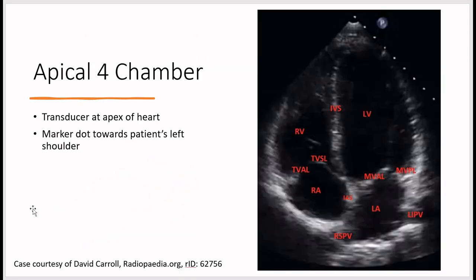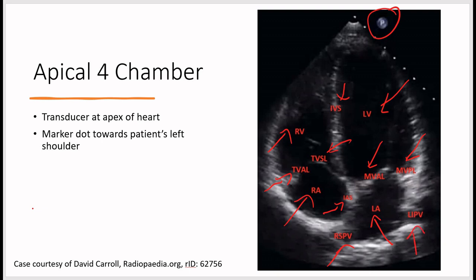For the apical four chamber view, move the transducer to the apex of the heart and point it upward toward the patient's head to reach the base of the heart, with the probe marker toward the patient's left shoulder. Structures include the left ventricle, interventricular septum, right ventricle, tricuspid valve with anterior and septal leaflets, right atrium, left atrium, atrial septum, mitral valve with anterior and posterior leaflets, and the pulmonary veins — specifically the right superior pulmonic vein and left inferior pulmonic vein.